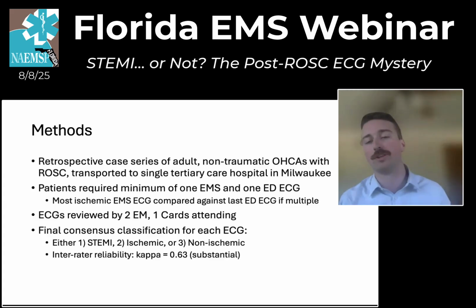If there were multiple EKGs acquired in either of those contexts, we used the most ischemic EMS EKG and compared it against the last emergency department EKG, as we felt that these would be the two EKGs that had the greatest weight when making clinical decisions in either context. Certainly, EMS crews may use that most ischemic EKG to activate the cath lab in the pre-hospital space, and the most recent EKG in the emergency department would be most likely to inform disposition to the ICU or the cath lab for those patients.